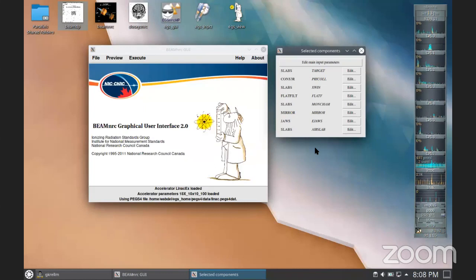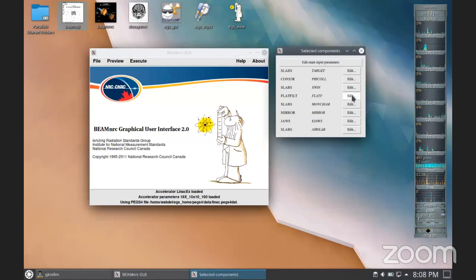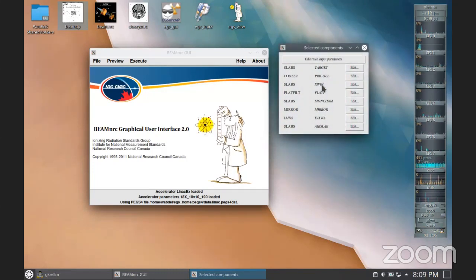Why is the uncertainty at 5 lower? Where? In those 5, well, you have to go and look at the region. Maybe it's a large region in the dose file. Because you have a larger volume, you get statistics quickly and actually a lower uncertainty there. But my suggestion is, we ran a small number here, about 7,000, so try to run more particles when you do this.